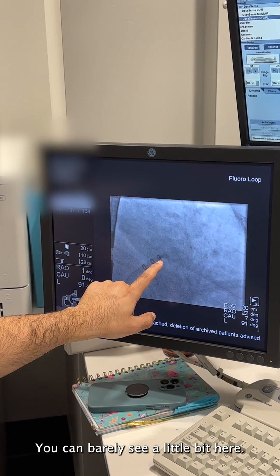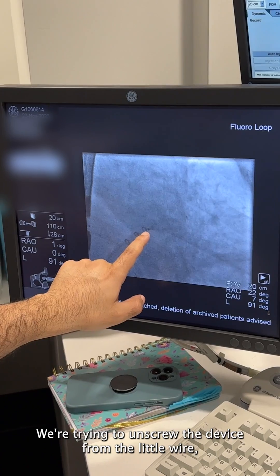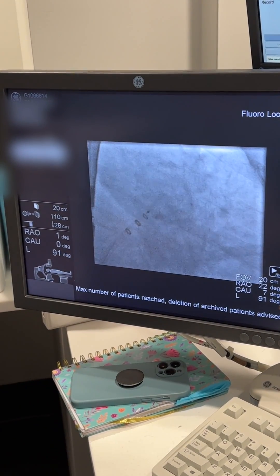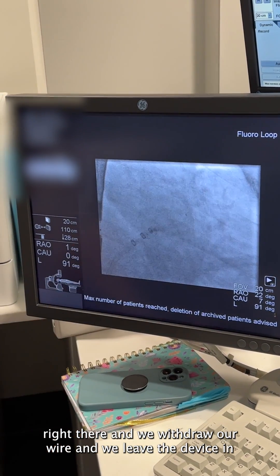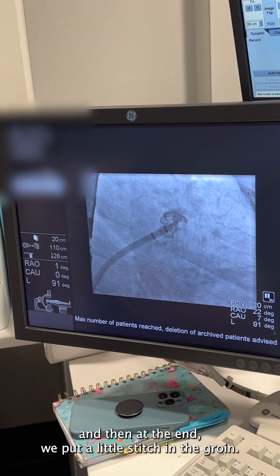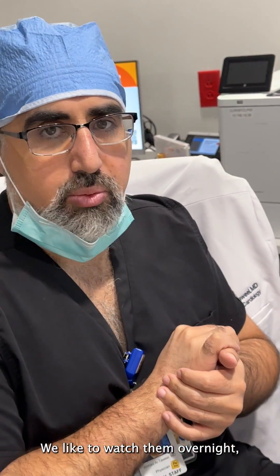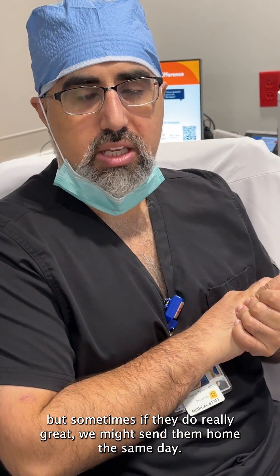You can barely see a little bit here. We're trying to unscrew the device on the little wire, and once it's unscrewed we withdraw our wire and leave the device in. At the end we put a little stitch in the groin. The patient is awakened and they do well. We like to watch them overnight, but sometimes if they do really great we might send them home the same day.